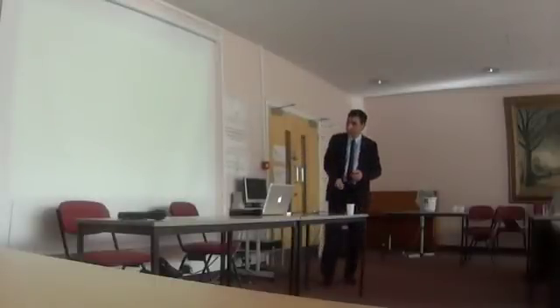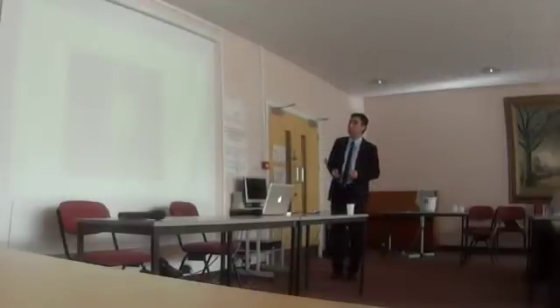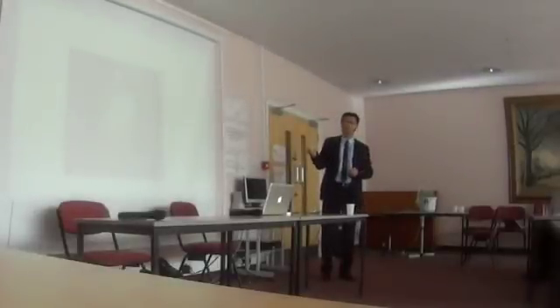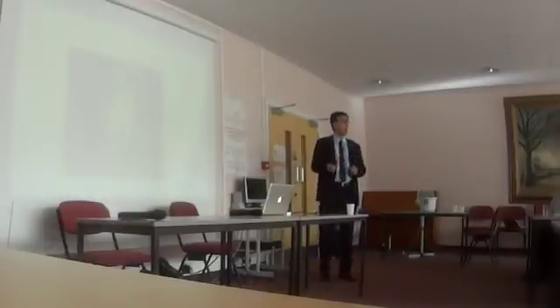There are several things we can look at. Does he have a hypertrophic cardiomyopathy? Has he had a heart attack? Has he had a dissection? So we did the MRI on him. Again, he was lucky, one of those we could put under the magnet. Most of the time we cannot, because these cases are not elective. MRI is mainly elective rather than emergency, although occasionally we can do it.